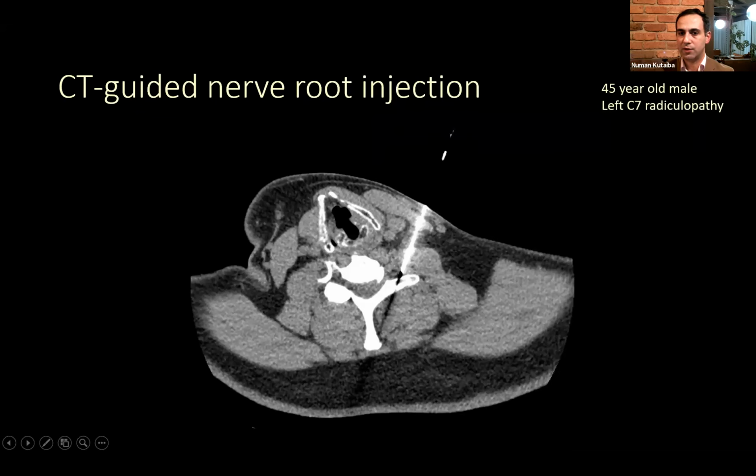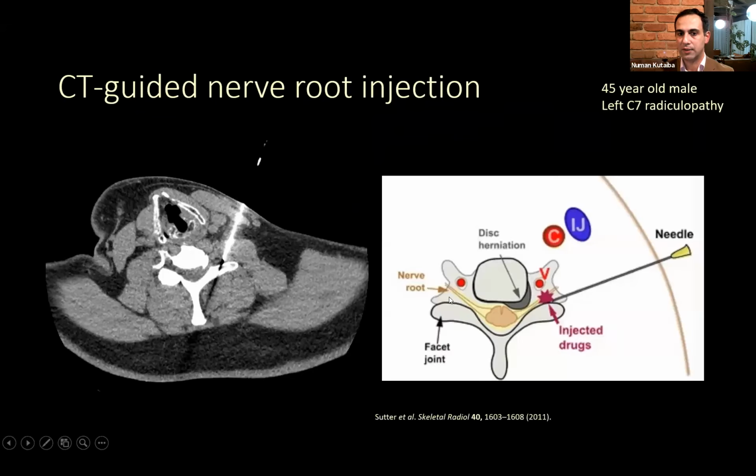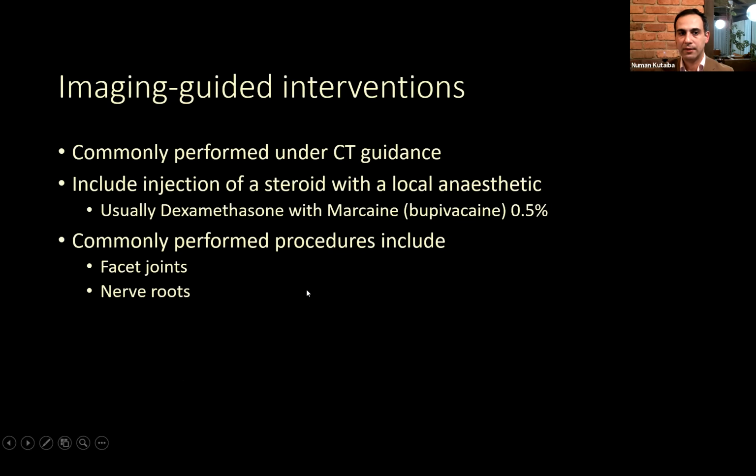This patient underwent a CT-guided nerve root injection. With the CT-guided nerve root injection, basically you're positioning the patient on their back, you're asking them to tilt their head towards the other side. You've verified the level where you want to inject. You advance the needle away from the carotid artery and the veins, away from the vertebral artery, which is very close. You get close to the nerve. You don't necessarily see the nerve, but you know where it will be exiting, and you place the needle and you put some steroid and local anesthetic.